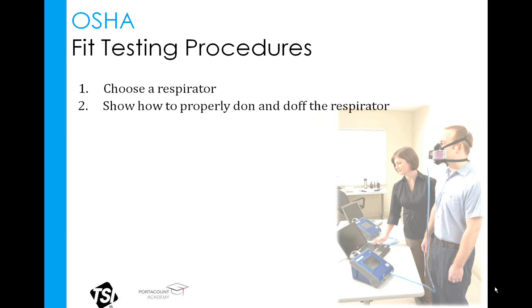Step 2 is where you show the employee how to properly don and doff the respirator. This information should be obtained from the respirator manufacturer, and I would stress that teaching them how to properly doff the respirator is just as important as teaching them how to don the respirator. If they get claustrophobic during the fit test, we don't want them pulling out their hair trying to remove that respirator.